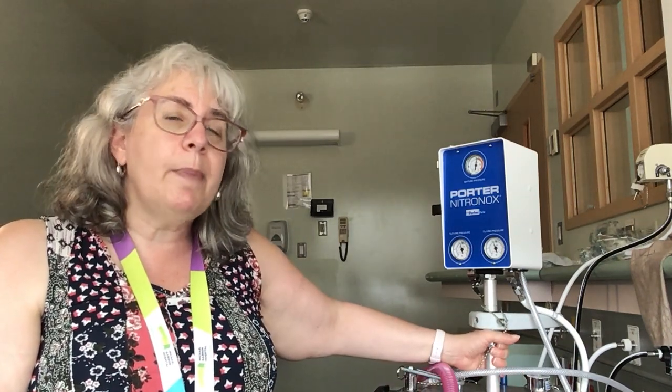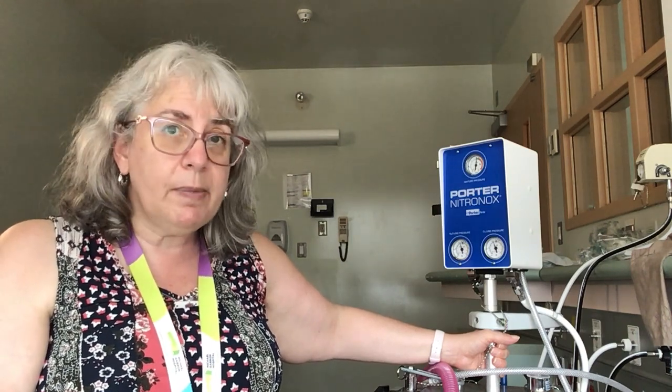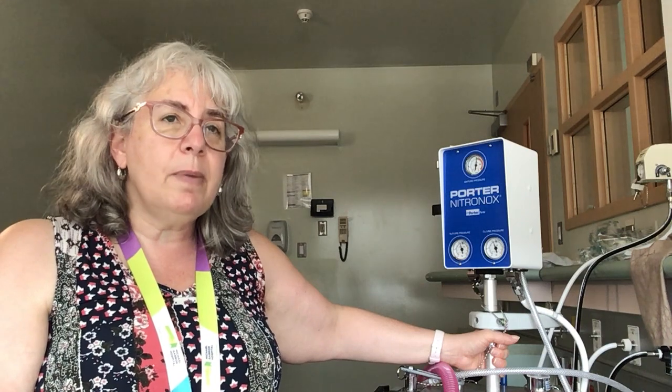Now, because we only have 2 of these units on the floor, we probably don't want to use it for someone who's 3 centimeters dilated for hours and hours. Unless that person has a total contraindication against an epidural, and they do not want to have a PCA, they want to have something in labor, and then again you can make that decision.